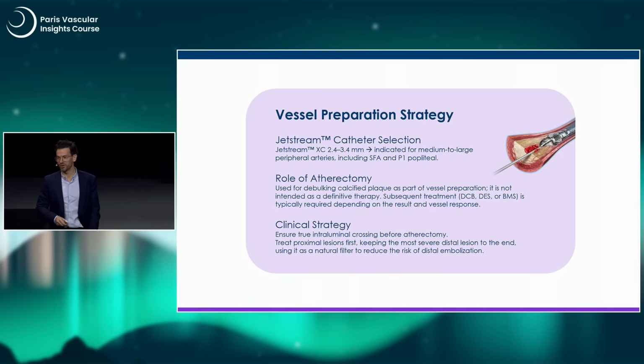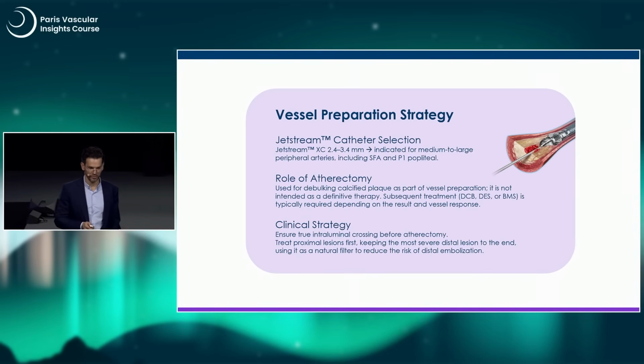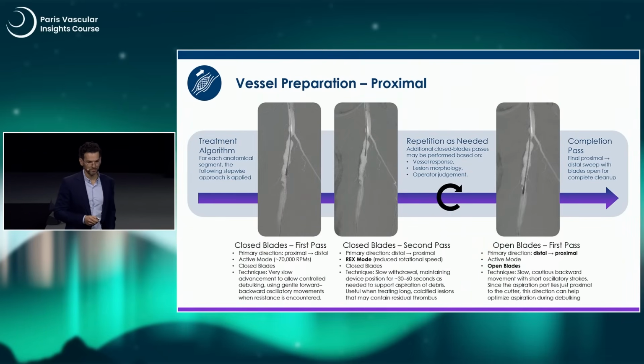France is a poor country, so Jetstream is not reimbursed, and of course a filter neither. So I almost never use a filter with Jetstream, but of course I have major concern about distal embolization, as everybody. I'm a Jetstream user for 10 years now, and we have a very low rate of distal embolization, thanks to a very cautious use of Jetstream and some tips and tricks to avoid this distal embolization. So this is the role of atherectomy that I've just summarized before. And then we'll move on to this.